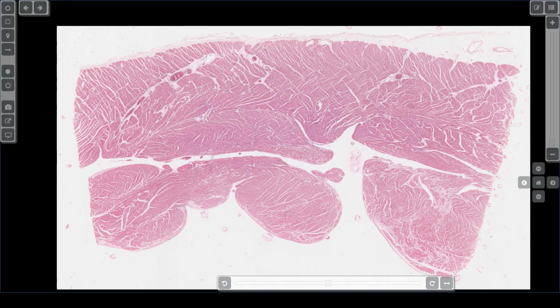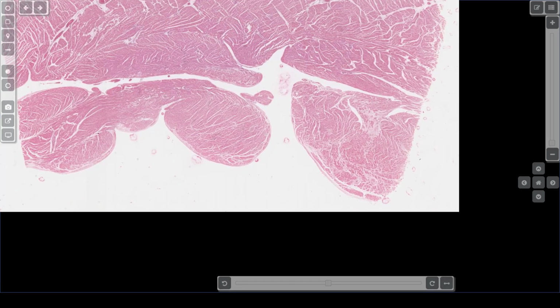If you are going in order, the next layer would be the Purkinje fibers, which you can see pretty well right here. However, you can't always see the Purkinje fibers in every single cardiac section. Let's take a closer look.